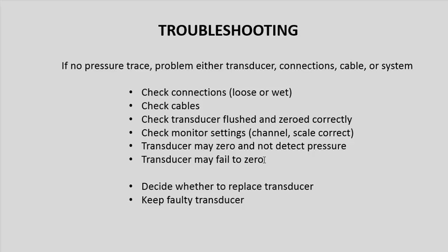But you don't want to replace a perfectly good transducer, so you must go through your troubleshooting sequence. You've got to decide whether to replace it or not, and sometimes it can be quicker just to replace it and hope it works, and save all the time that needs to be done to isolate the fault. But eventually you must isolate the fault and keep the faulty transducer for checking.